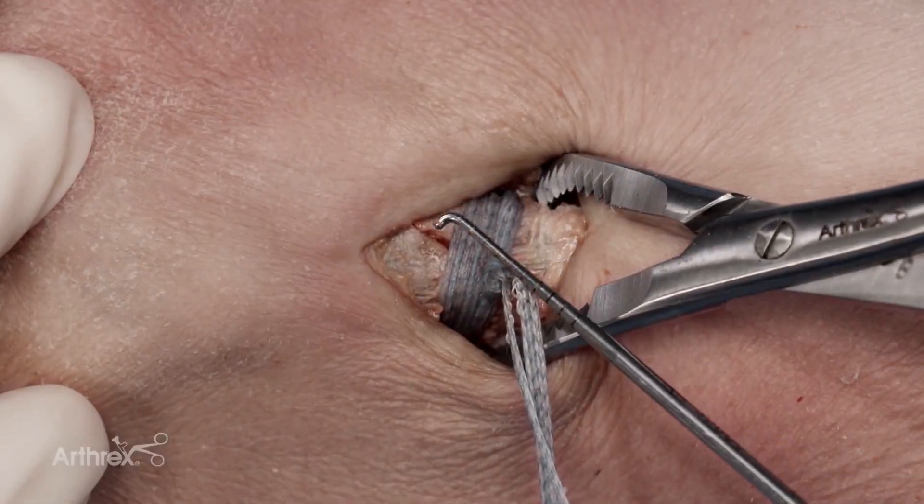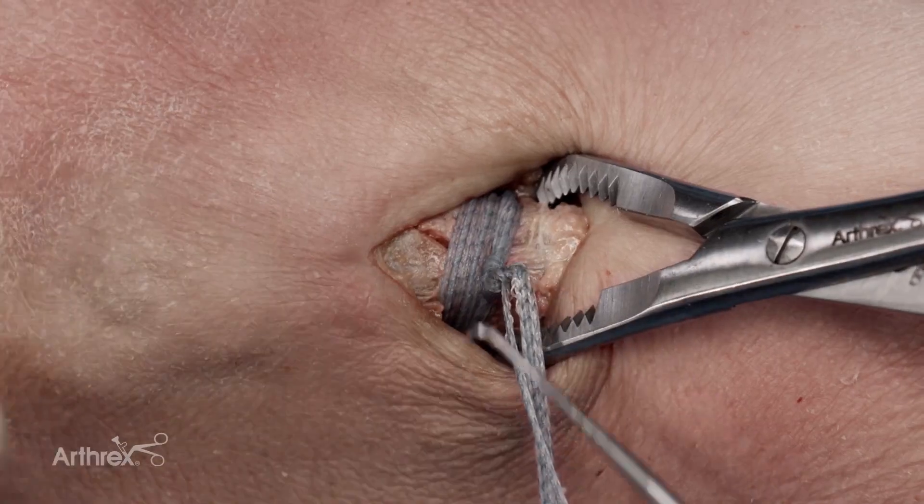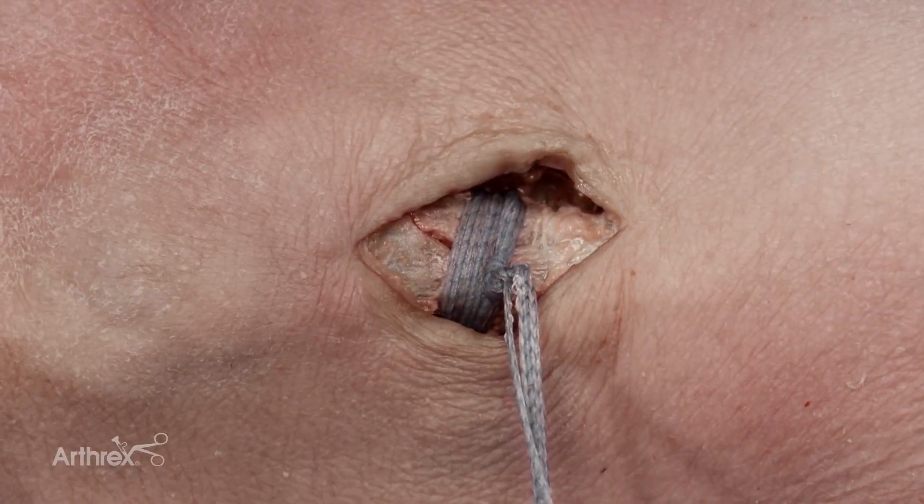The fiber tape cerclage is now tensioned. I have anatomic reduction and compression across the fracture site, and now the clamp that was holding reduction can be removed and the reduction is maintained.